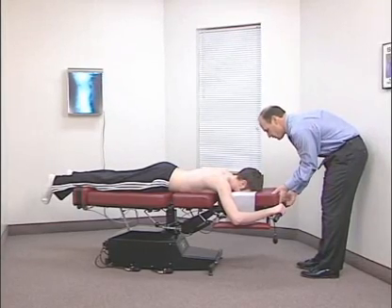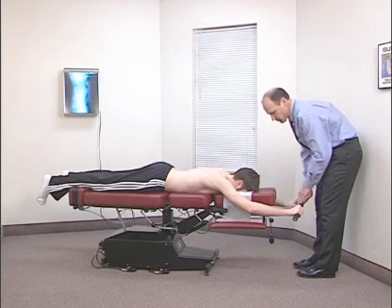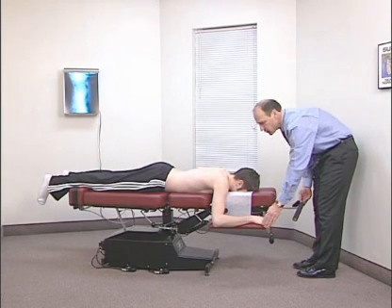Pull back on the handlebars slowly until the patient's elbows are slightly flexed. Patients can exacerbate injured shoulders, elbows, or wrists if the handlebars are pulled out too fast or too far. When a shoulder, elbow, or wrist problem is present, instruct the patient to grasp the ends of the armrest.